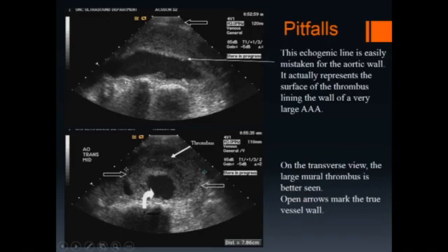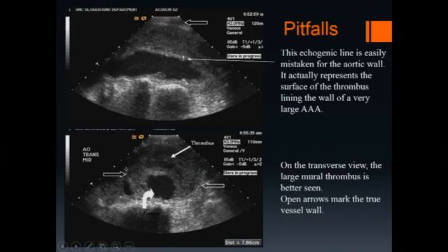This slide illustrates a common pitfall. In this case, the inner wall of a thrombus is mistaken for the wall of the aorta. This echogenic line actually represents the surface of a large thrombus that is lining the wall of an abdominal aortic aneurysm.